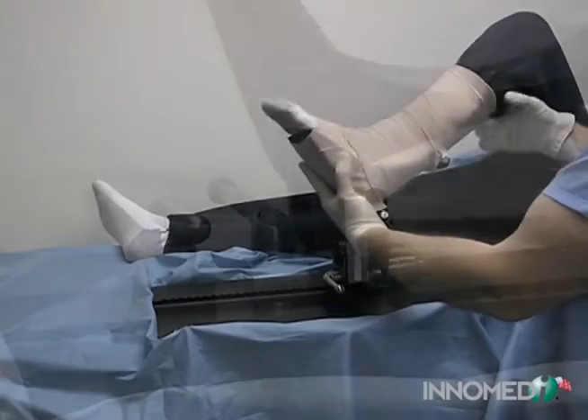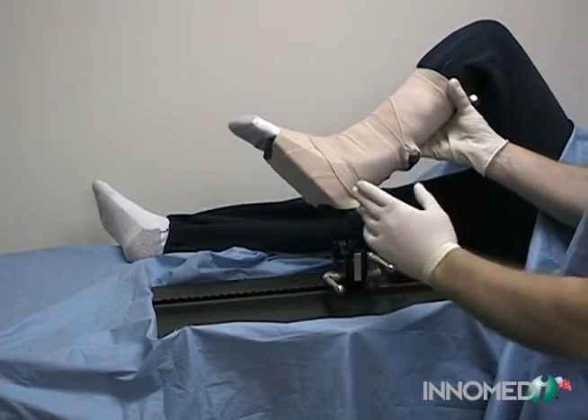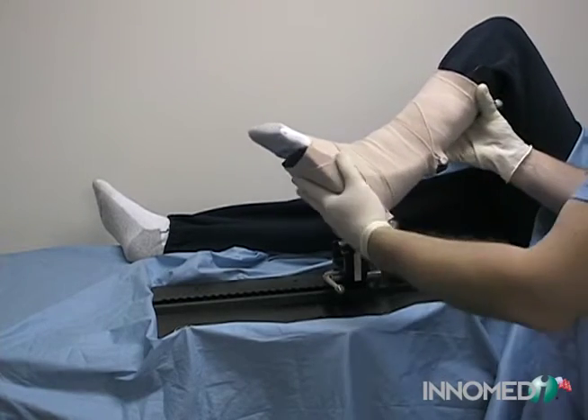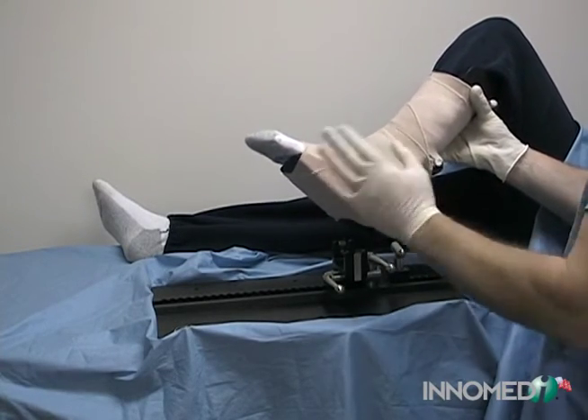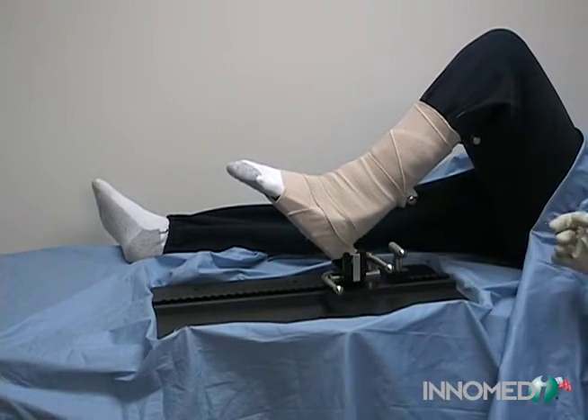The foot of the patient's operative leg is placed into the foot support and wrapped with a standard ACE bandage. Care should be taken not to cover the pegs on the foot piece. Additional sterile cotton padding may be inserted around the foot if necessary for thinner patients.